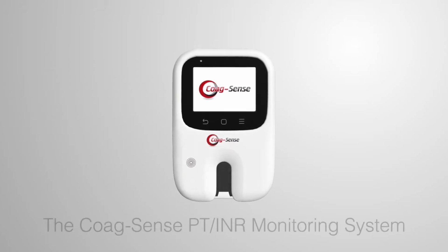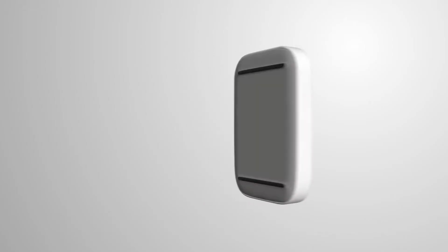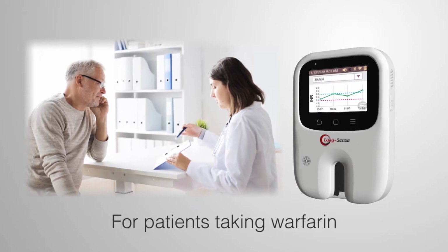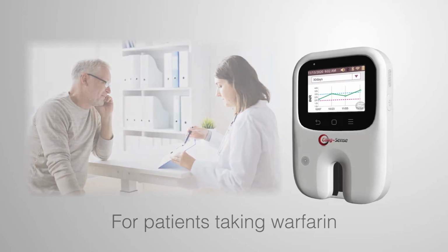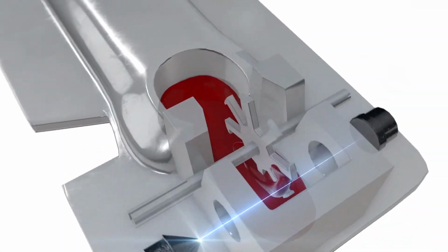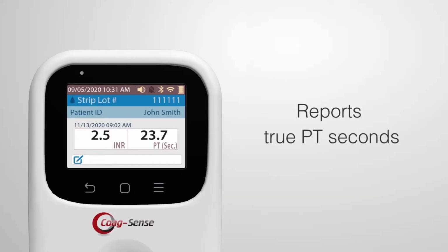Thank you for choosing the Coag-Sense PTINR monitoring system. The Coag-Sense system is used to test prothrombin time, PT, in patients taking warfarin for oral anticoagulant therapy. Results are reported as International Normalized Ratio, or INR units, and PT seconds. Since the system directly detects the clot formation, it reports true PT seconds.